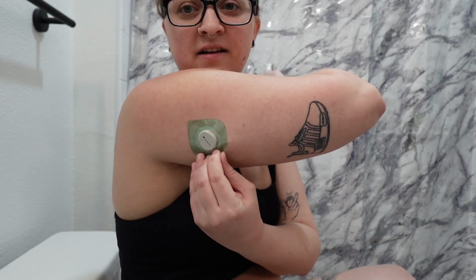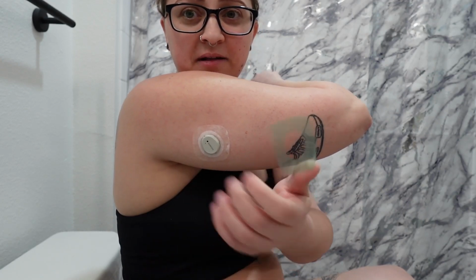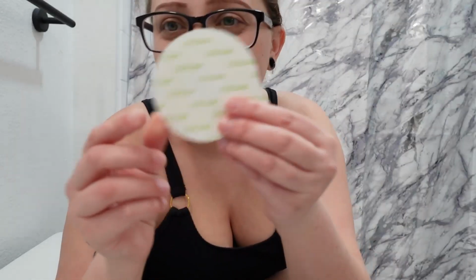And then we peel off and it stays. I already know that there's bumps. It's fine. We're gonna go ahead and do the same thing with the Libre.